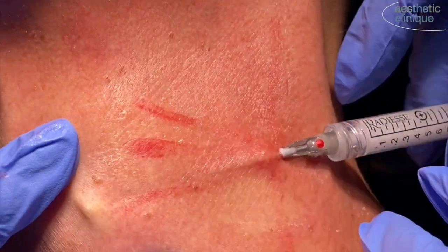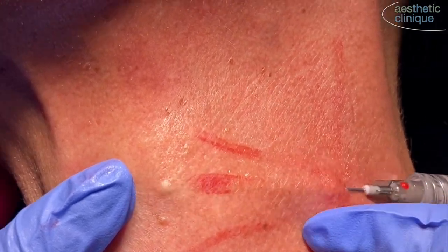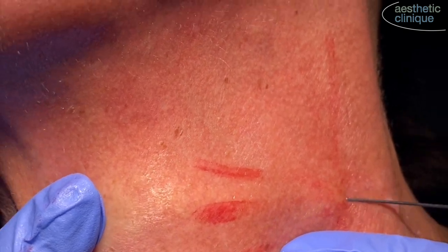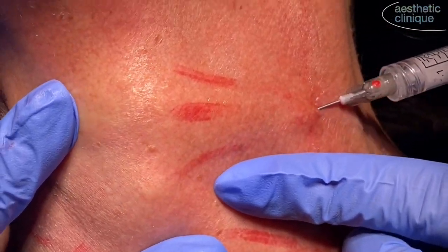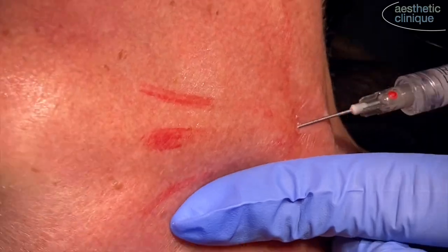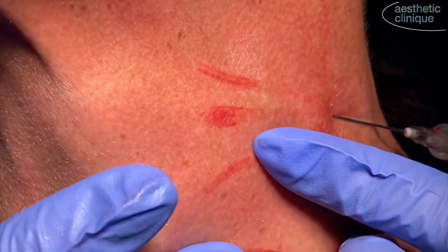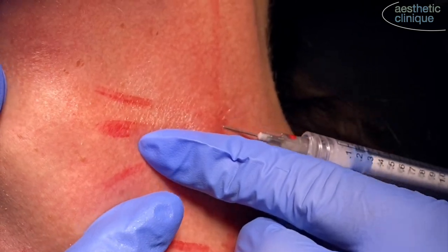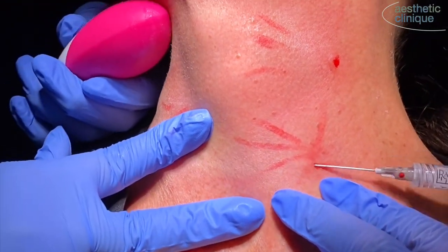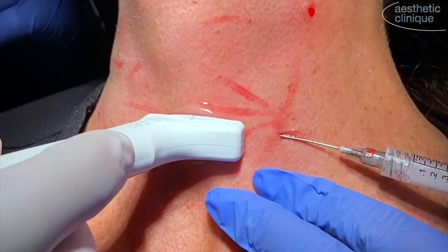just underneath the dermis. We're using a 22-gauge cannula for this, and we like the soft-fill cannulas. We use four entry points — two along the sternocleidomastoid muscle on each side — and then a more superior medial injection site for the submental area. We use a fanning technique for this, and we distribute the Radiesse in a very thin layer.